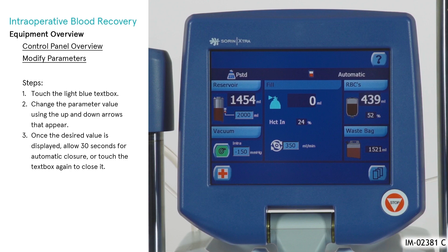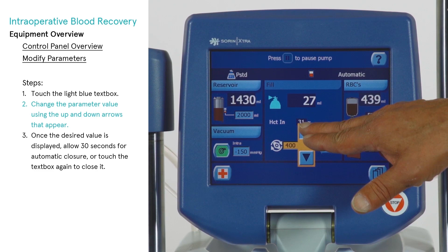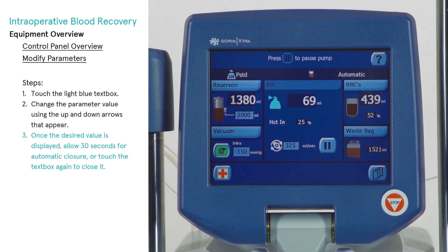To modify the value of a text box, perform the following steps. First, touch the light blue text box. Then change the parameter value using the up and down arrows that appear. Once the desired value is displayed, allow 30 seconds for automatic closure, or touch the text box again to close it.